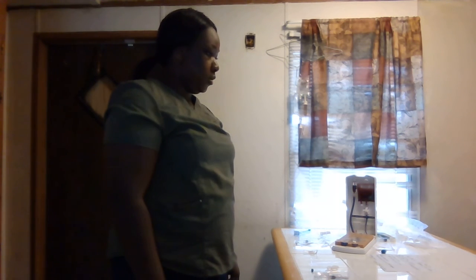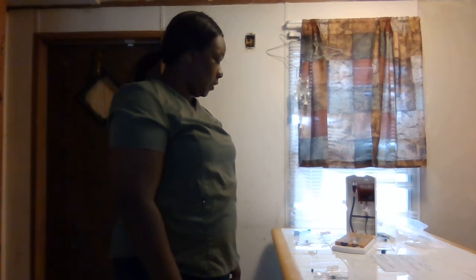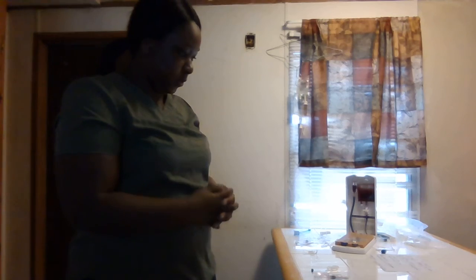Okay, so now the doctor has ordered that the patient is fine. He can go home. He told me to discontinue the IV and let him know that he has a follow-up appointment in a week at his office. So again, I'm going into my patient room. I let him know the doctor discharged you home. It's time for me to go ahead and discontinue your IV.